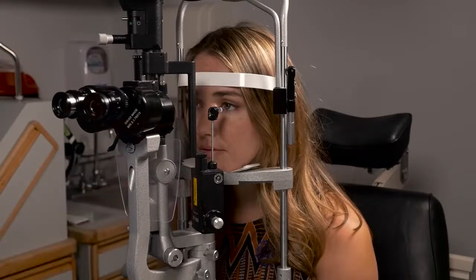And it's nicely lined up right there. So next thing I'll do is there are different settings on the power of the beam itself. I usually set it on the half. There's a half and a 1. You don't need to blast them with light, but at the same time, you brought them here to do an eye exam, so you might as well make sure you have enough light to be able to see.